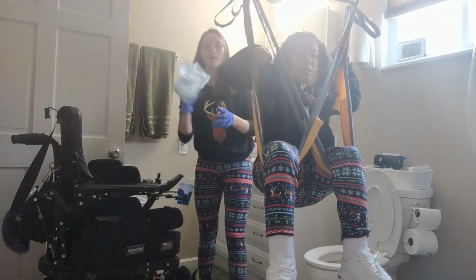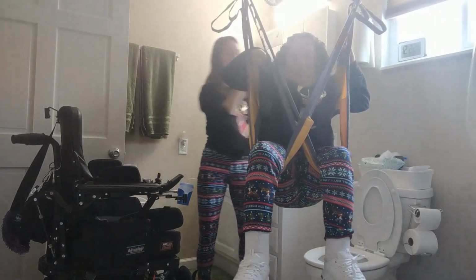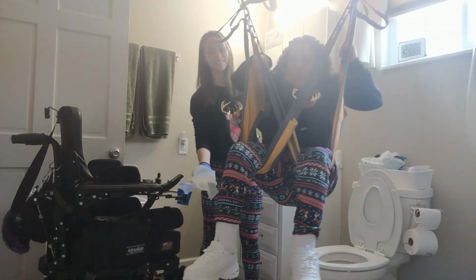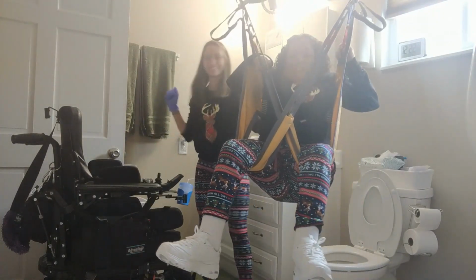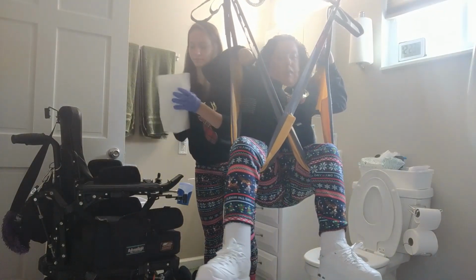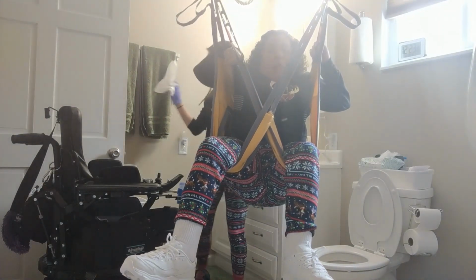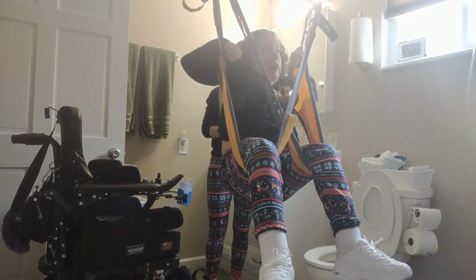We're going to use baby wipes first. We're going to do 2 of them, and kind of overlap them. And then you just wipe front to back. Wipe it down. If you need to do that again, you can. Yeah. And then you use paper towel to dry it off. Yep, and the reason for that is we want to get any moisture away from my body because infections like dark, moist places. So to avoid that, we make sure we dry.